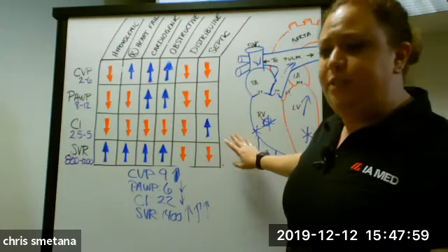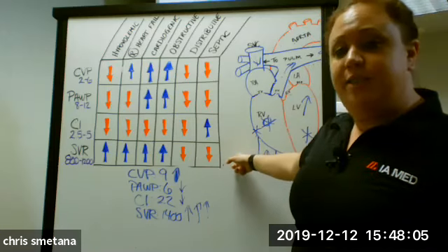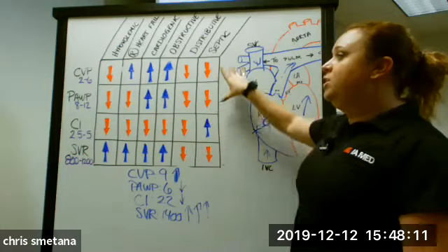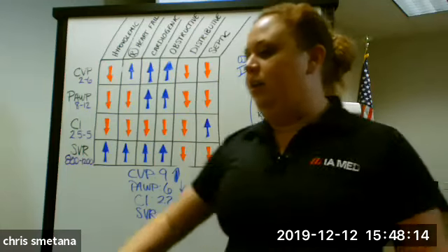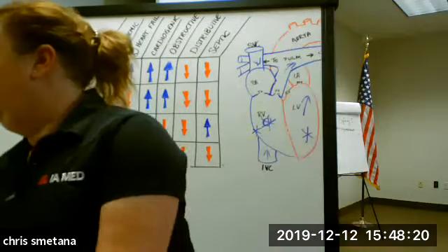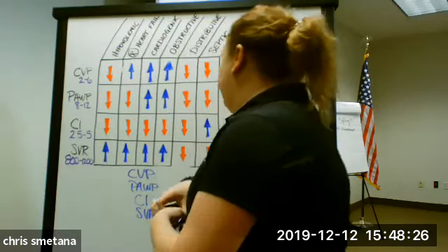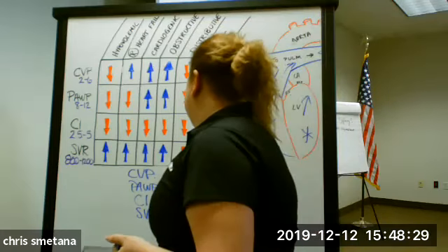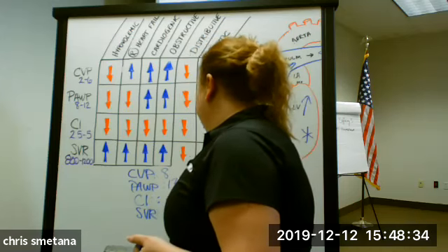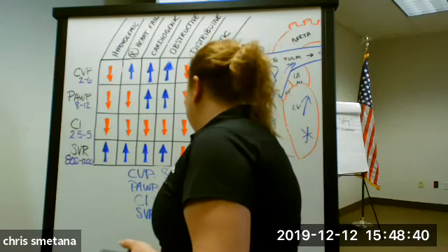Where we see a little bit more of this used in the transport environment or in the real world, we'll start to monitor their SVR and stuff like that to make sure that we aren't over pressured or using too many pressors on somebody. So if you do have somebody where, say, we had all of these lab values, let's say we had somebody where their CVP is at 8, their wedge pressure is at 13, their cardiac index is at 4, their SVR is hanging out at 1600.